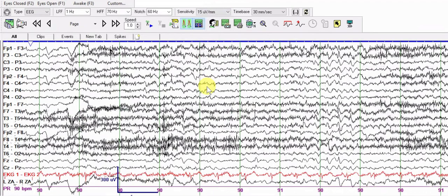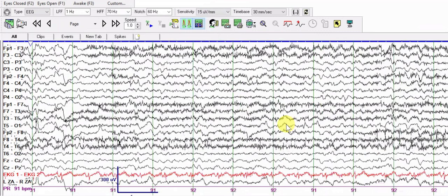You should monitor the ECG rate — here it is 90 beats per minute. Keep an eye on whether the ECG is regular and what the rate is. This is a 24-year-old patient with cognitive delay and intellectual disability, and there is a lot of slowing in the background.